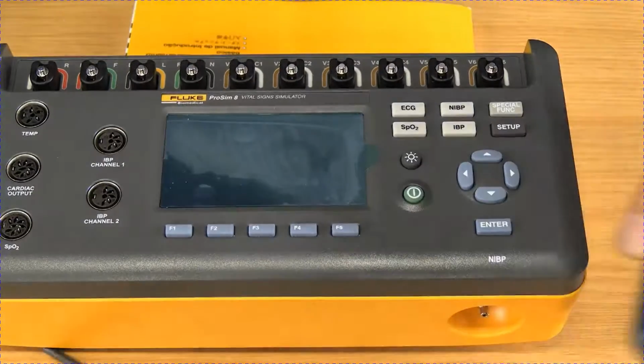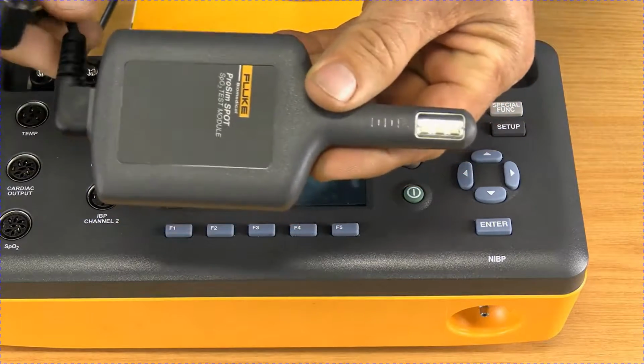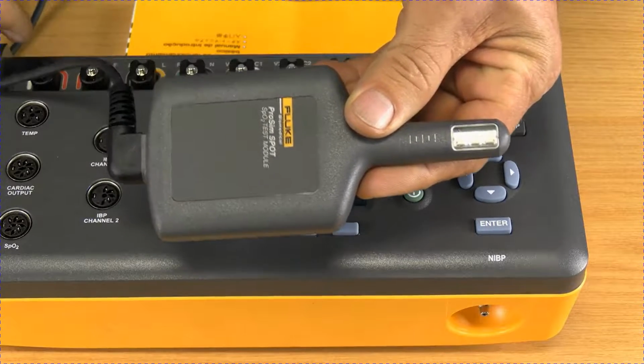Hi everyone. What we're going to look at now is testing the SpO2 functionality on your patient monitor. And again, we're going to be using the ProSim 8 simulator together with the ProSim Spot, which is the SpO2 simulator which you use with the ProSim 8.